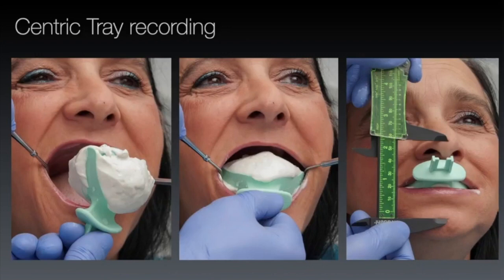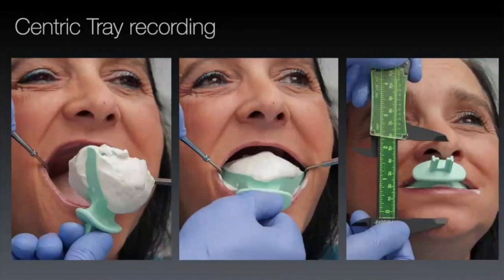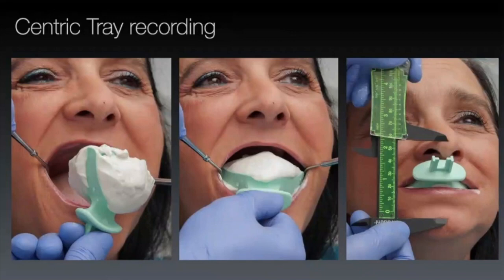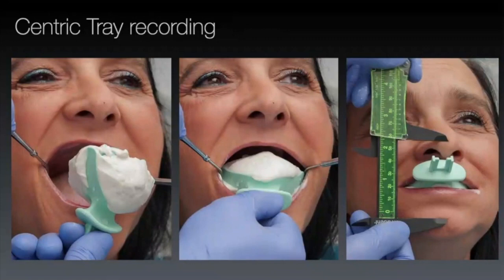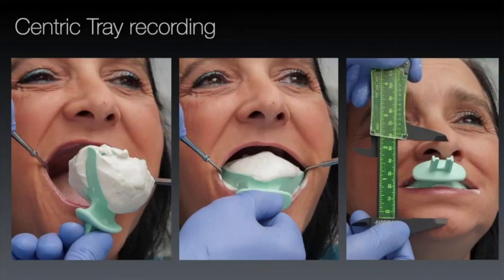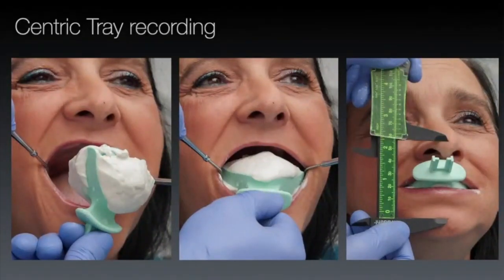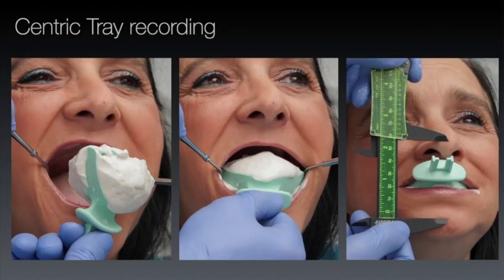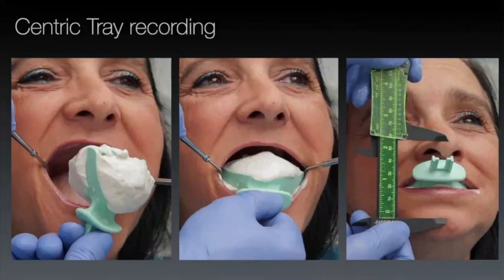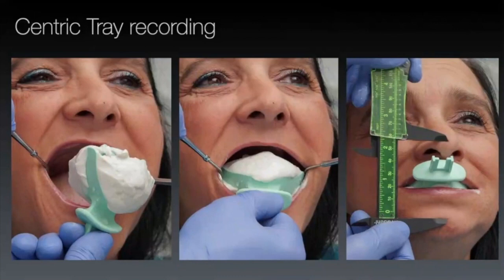The idea is: if you close your natural teeth together and relax, your teeth will be around three millimeters apart. Everybody relaxes more or less in the same position. If you get a patient to relax with lips closed, put a dot on their nose and chin and measure — that might be 70mm. We know freeway space is around three millimeters on average, so subtract three millimeters to get the closed-mouth OVD.